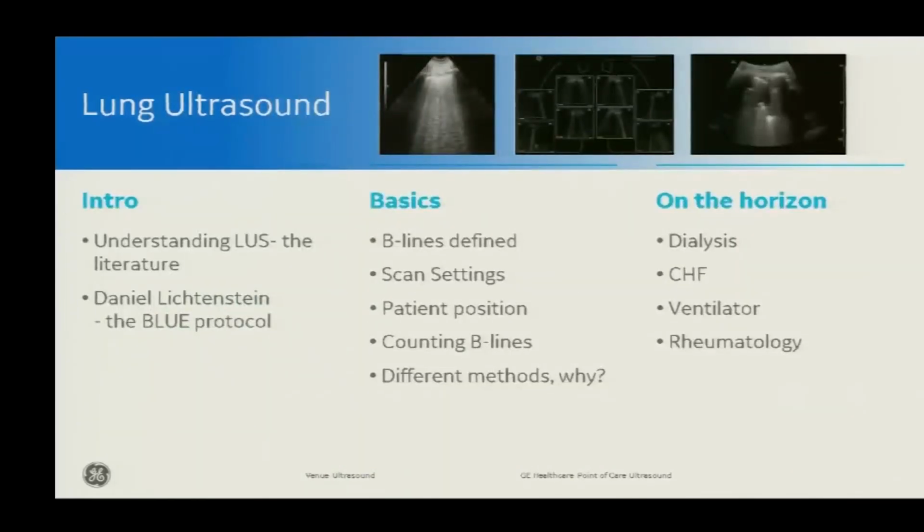So here's a list of some of the things that I want to talk with you about today. We want to understand the lung ultrasound literature a little bit, so I just spoke to that. I wanted to introduce, if you haven't heard of him already, Dr. Lichtenstein, who is the father of the BLUE protocol. This is a common protocol that's used to evaluate the lungs with ultrasound, and you will hear about it.